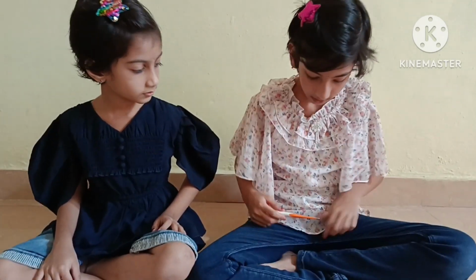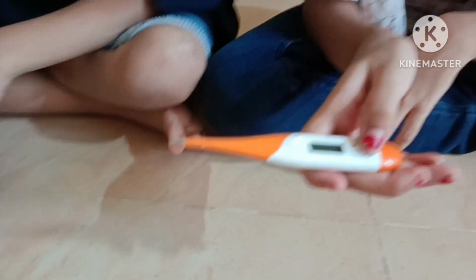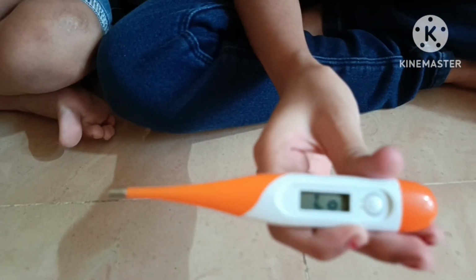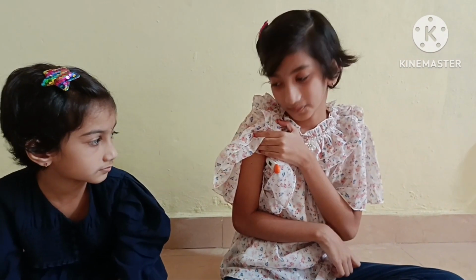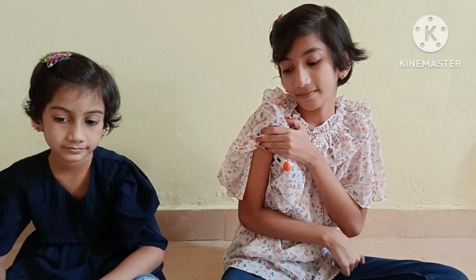Now let's check of me. Before giving to another person, we should clean it with the cloth. Again, L0 comes. When L0 comes, we should wait. Okay, it came now. Now it is ready to keep. We should hold it tightly. When beep sound will come, then we should remove.